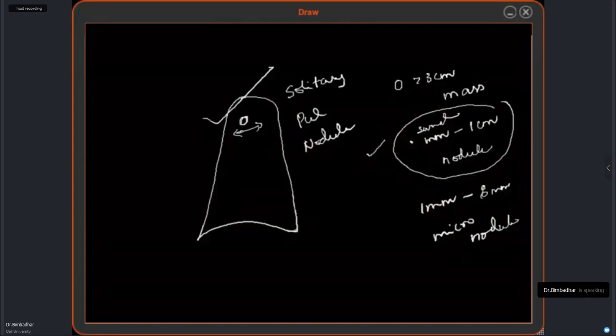And how can I define this? Prominent, discrete, calcified granuloma-like nodules diffused all over the lung fields are a characteristic feature of what? Varicella pneumonia. Or you can technically say that most viral pneumonias will show up as multiple prominent calcified granulomas distributed all over the lung spaces. So multiple small calcified granulomas are a characteristic feature of varicella pneumonia. Okay, simple.